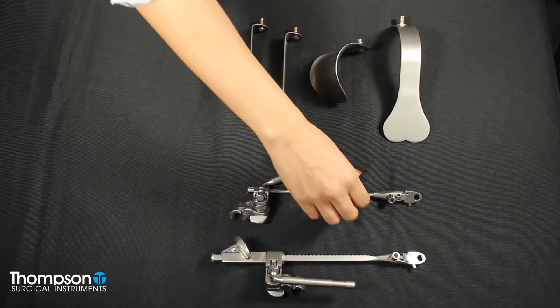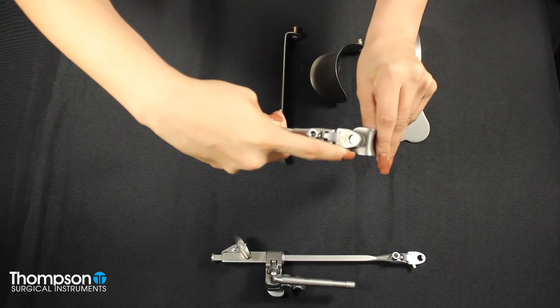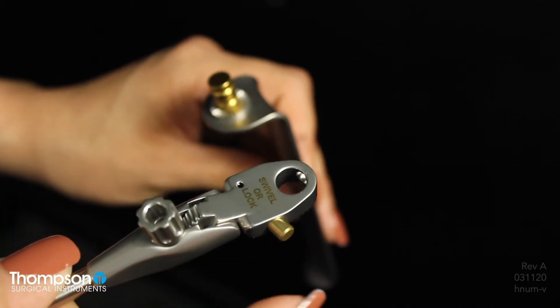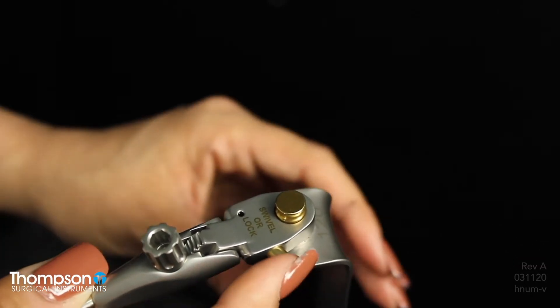Your frame setup is complete and now it's time to add your handles and blades. Select the retractor blade and handle you wish to use. While pushing the handle's plunger, insert the blade nipple. Keep in mind that this step may be done before or after attaching the handle to the frame.